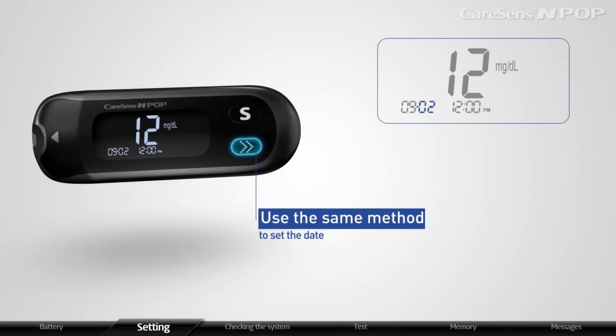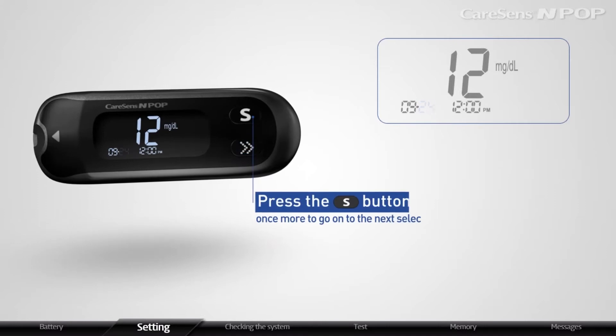Use the same method to set the date and press the S button once more to go on to the next selection.